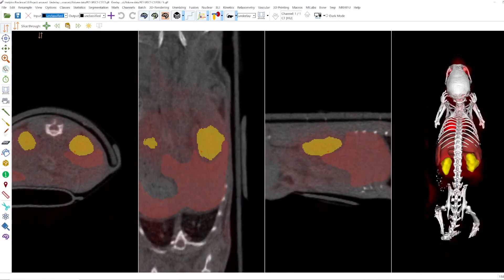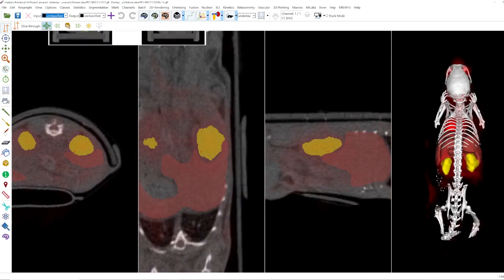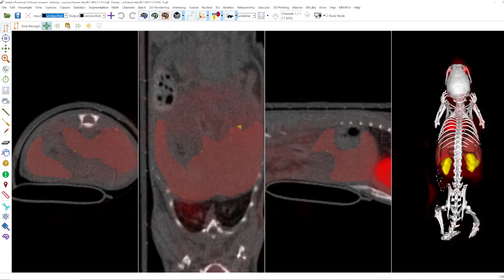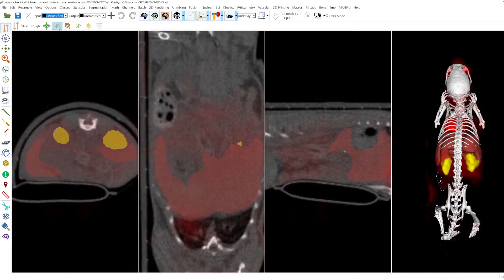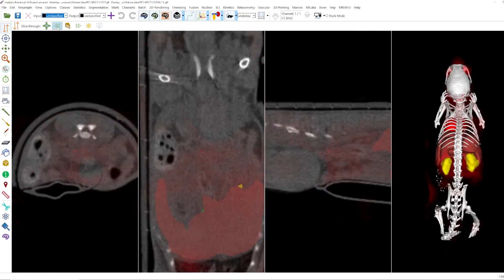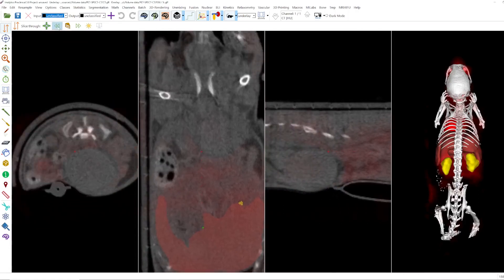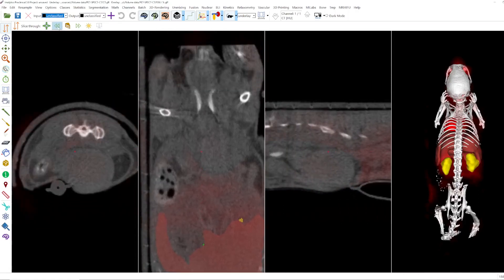With this button here you can go to the center of the sample — for example here to the liver — and with this you jump 10 slices down along the axial slice view. Of course all the other slices are also moving.